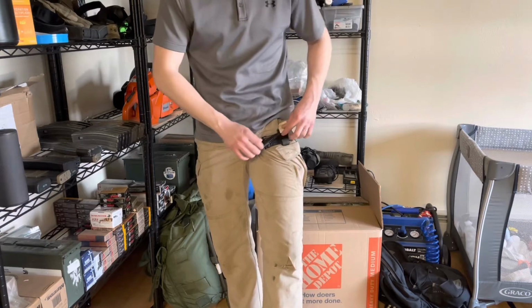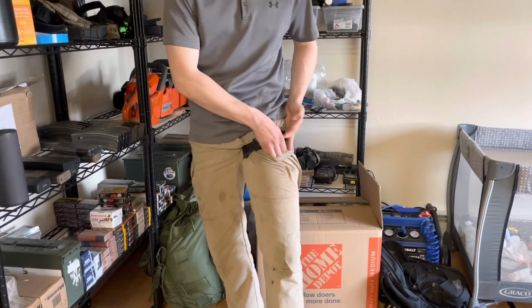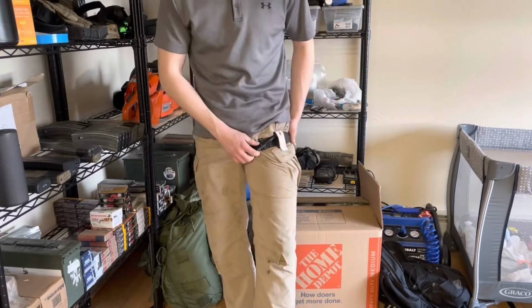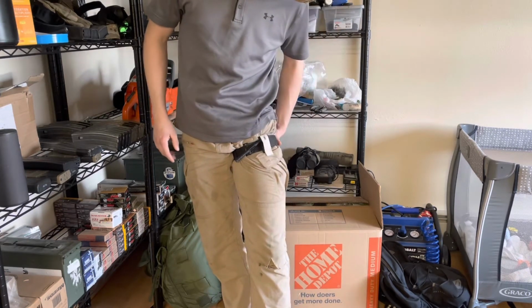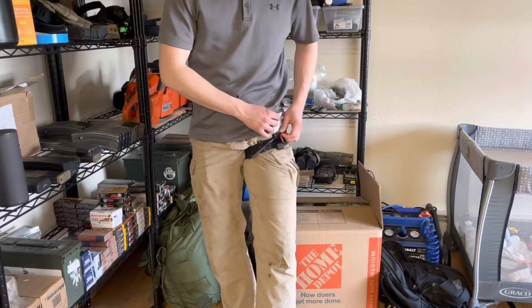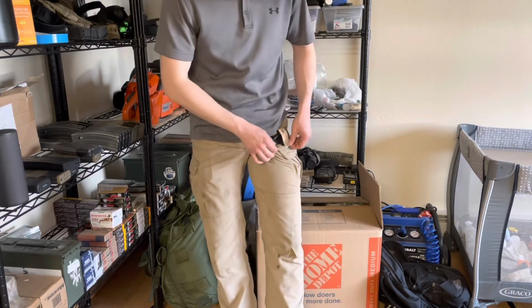So when you go to secure this, just put that over. If you have enough material to secure that too, go for it. But yeah, now, give me a second. Yeah, that's pretty much that. So if you're placing it on someone else, obviously you might have a little bit easier time getting leverage. I'm going to take this off because this hurts.